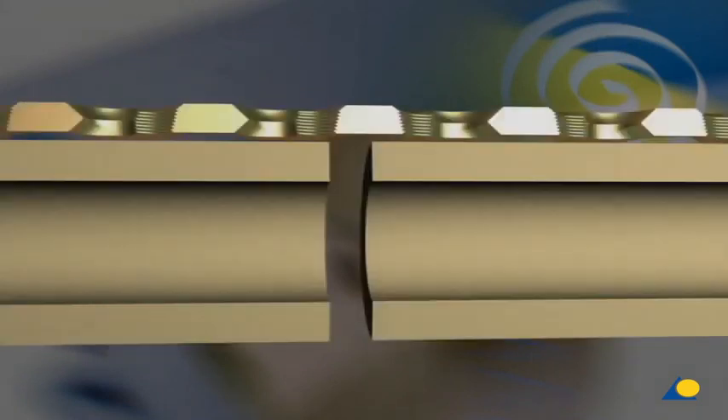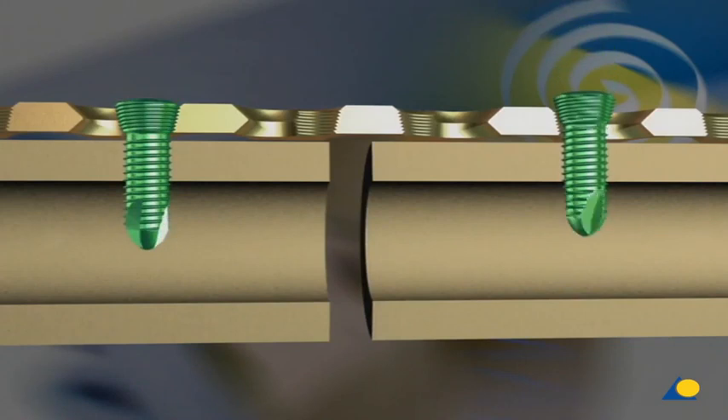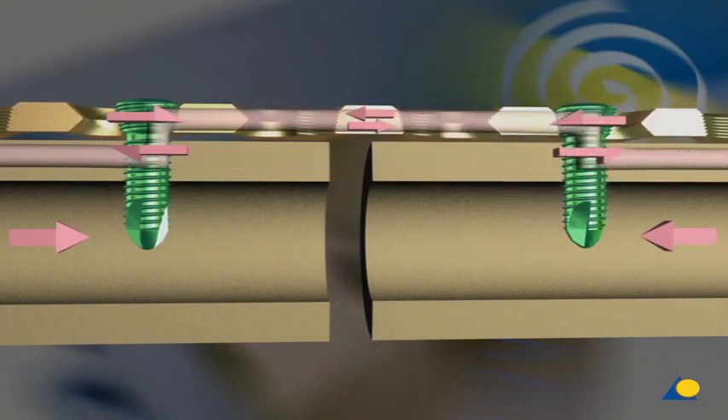The locking head screw is locked in the plate, thus preventing the bone from being pulled towards the plate. This protects the periost and maintains the blood supply to the bone. The forces are transmitted from the bone to the screws, from the screws to the plate, and then over the screws on the opposite side of the fracture and back to the bone. The stability of the internal fixation does not require any friction between the plate and the bone.